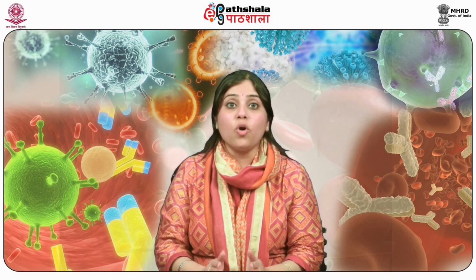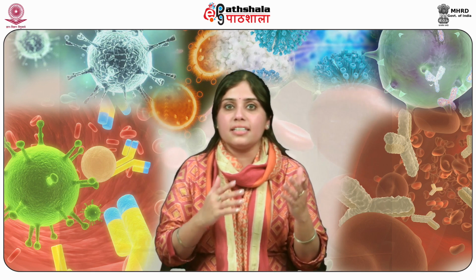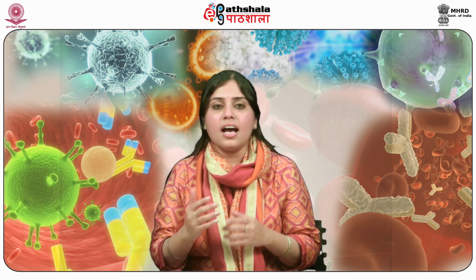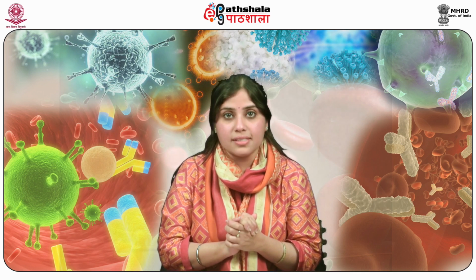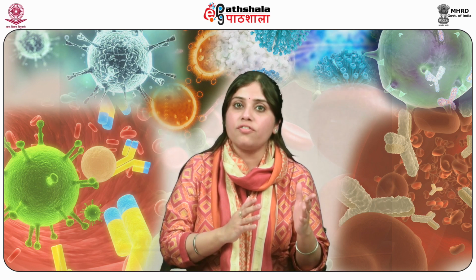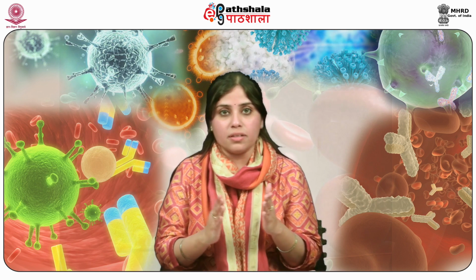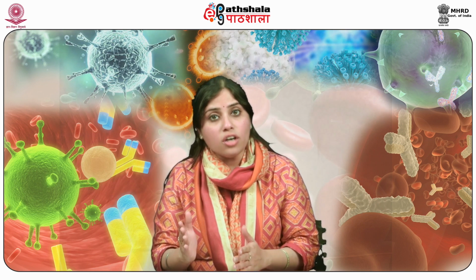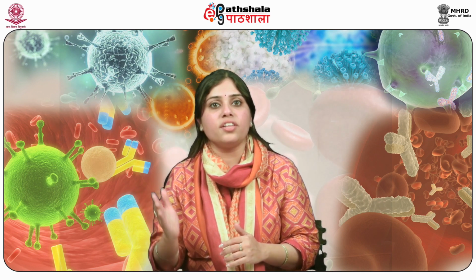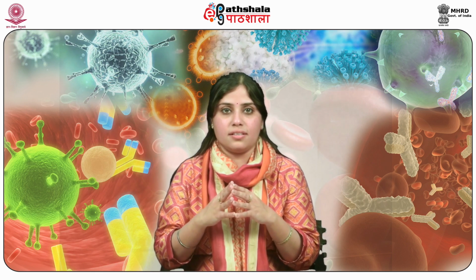Now coming to what the Coombs test means. When erythrocytes interact with antibodies, agglutination may not always result. This could be due to deviation of the antigen-antibody ratio from its optimal concentration or due to zeta potential on the erythrocytes preventing cross-linking of cells.